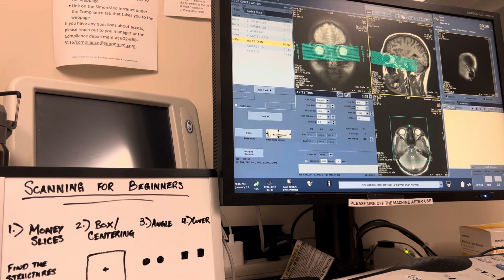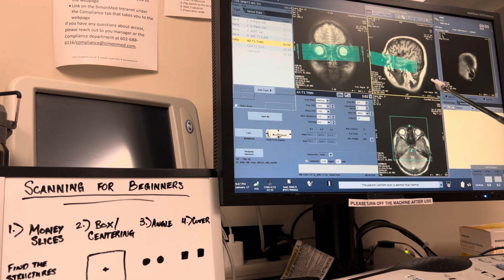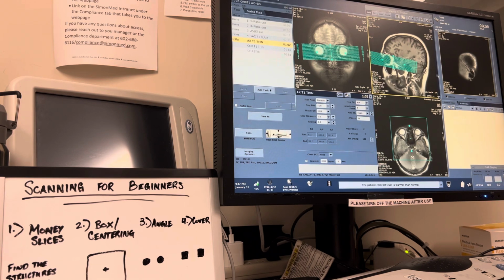There you go. Okay, so scroll down again. Remember, you have to scroll back and forth to see the average angle. So scroll down and then up. And then up. Yeah, you see, so that's probably a little better. Now let's go check the other orbit. Grab that and scroll all the way down past midline. There you go. Keep going one at a time. There's part of it, keep going. There's the other part. That looks pretty good to me.